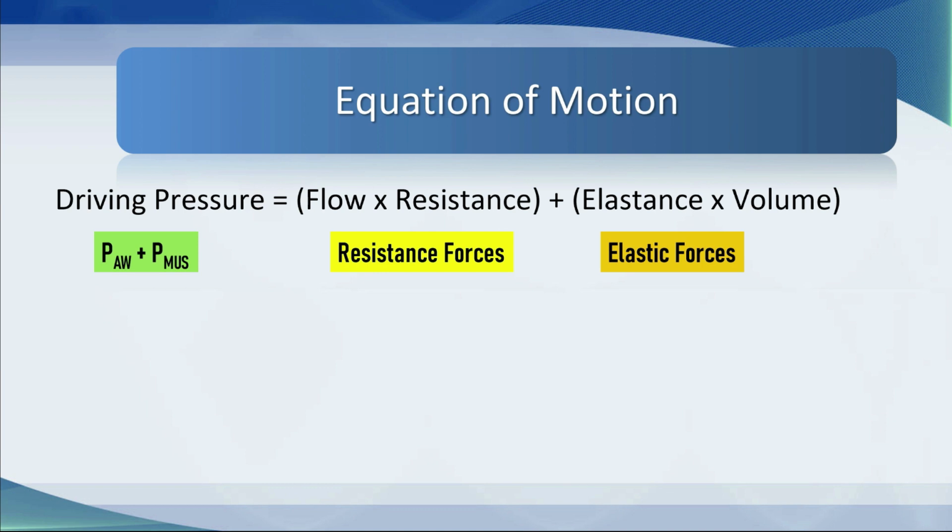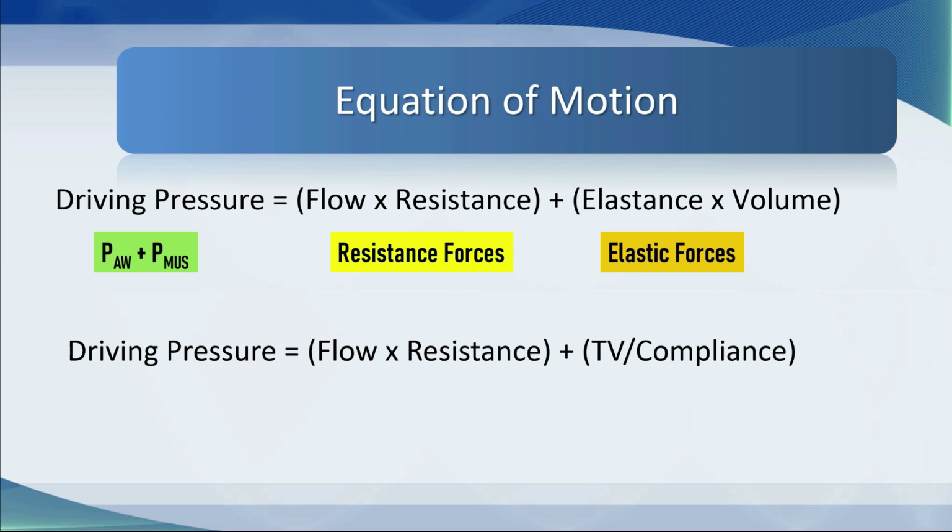To clean this up into nomenclature that we've used before, the driving pressure equals the flow times the resistance plus the tidal volume divided by the compliance. The compliance goes from 0 to about 100, so the greater the compliance, the greater the tidal volume.